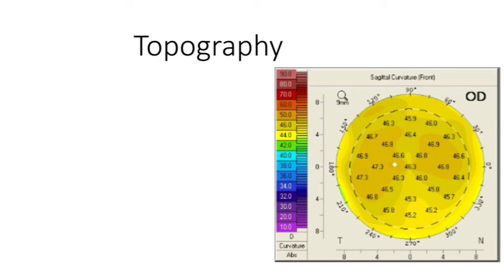Today in this video I'm going to discuss a very important topic that we all should know as an optometrist, that is topography. In this video I'm not going to discuss what topography is, its indications, its history, or its principle. You can get all these things from a normal theory book, so I'm not going to discuss that.